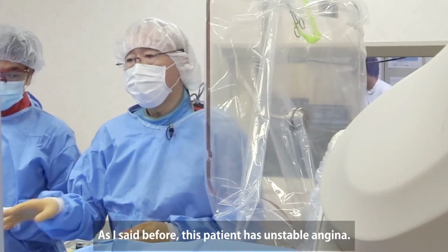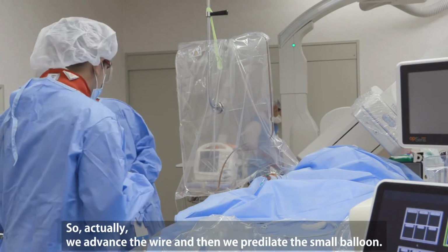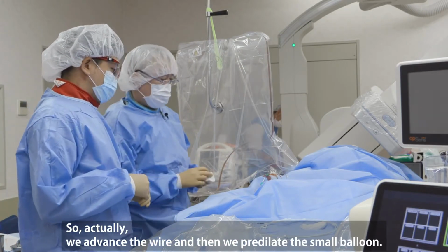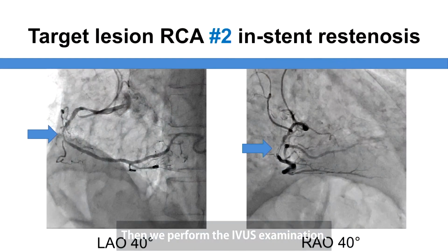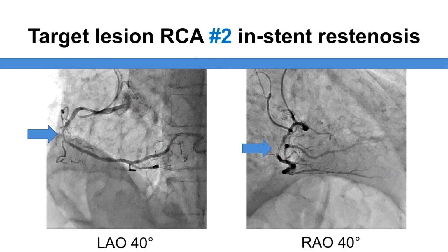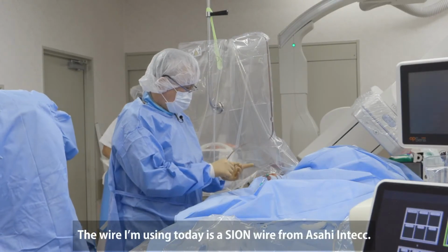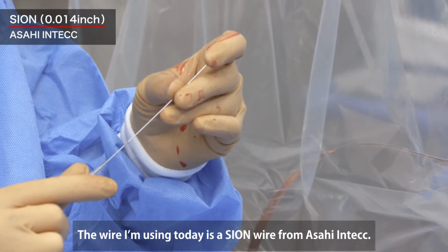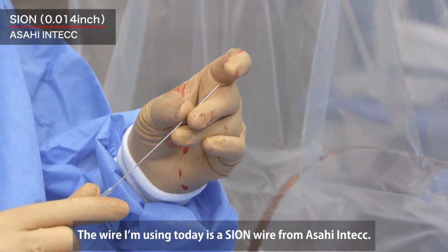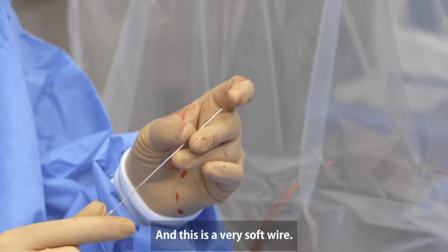As I said before, this patient has unstable angina, so actually we advance the wire and then we predilate with a small balloon. Then we perform the IVUS examination. The wire I use today is a Sion wire from Asahi Intecc, and this is a very soft wire.